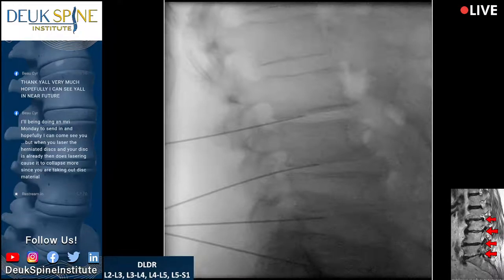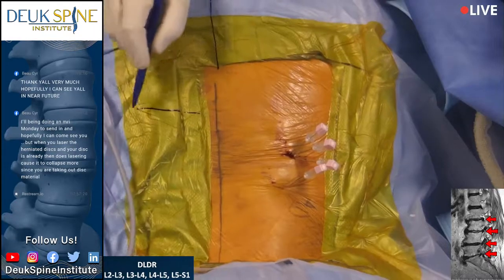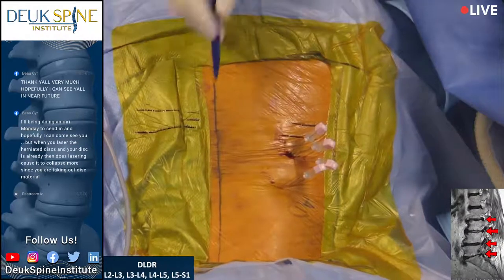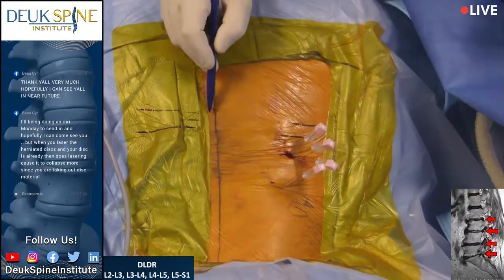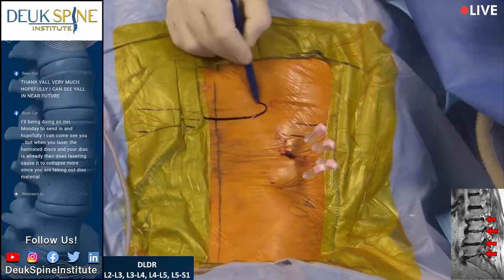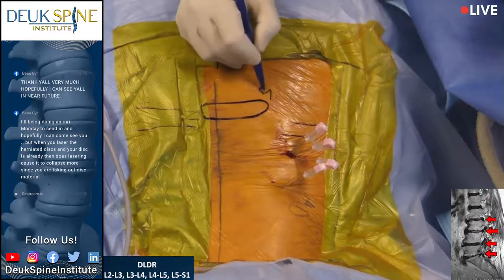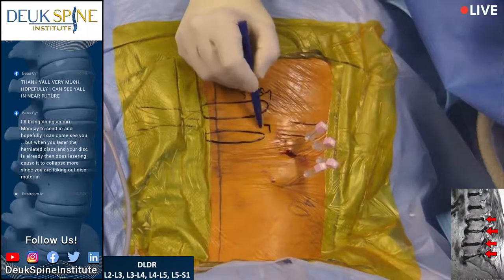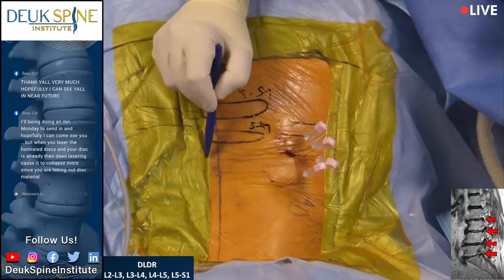All right. When I saw this patient in clinic, just so you all understand, his butt crack is right here. Why is that important? It kind of gives you a reference point. The belt is literally worn right about here. There's the belt. So the first disc we're going to repair is the lowest disc in his spine. It's right here, L5-S1. Above it is L4-5. And then L3-4.